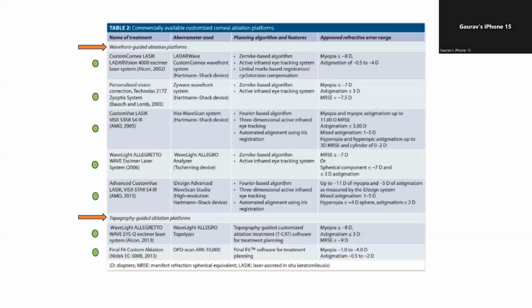So those problems with glare and halos from the initial days kind of went away, because you're getting a true optical zone which is much bigger and a transition zone to go with it. So it was blended. That is what I was trying to put across, because we used to read this a lot when we started doing wavefront optimized in 2002. But now most people would not know about it because we take it for granted. Anyway, let's go ahead.